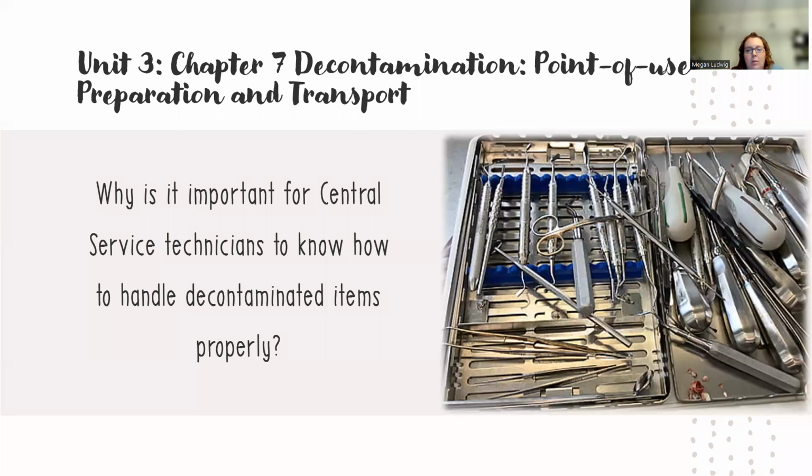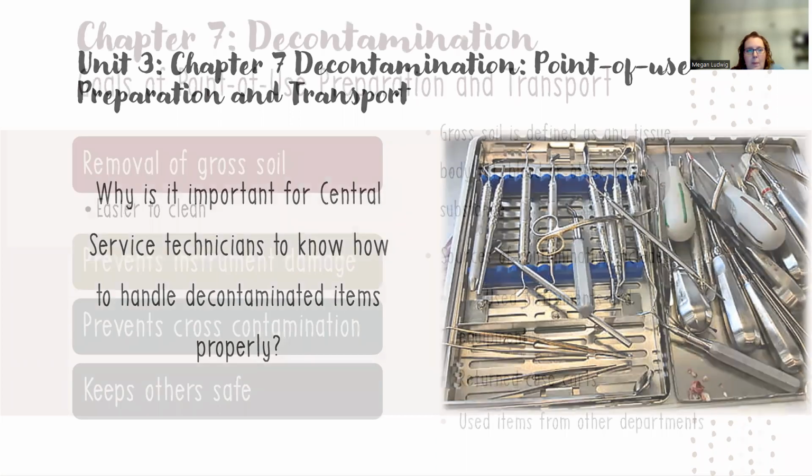Well, obviously this is going to be the big part of your job, getting back those dirty instruments. You want to make sure that you're handling them in a way that, A, is going to keep the life of the instruments for as long as possible, and obviously to keep those clean and protect yourself, then also prepare them for sterilization in a way that is safe for the patients.